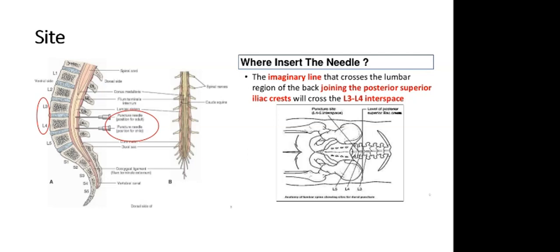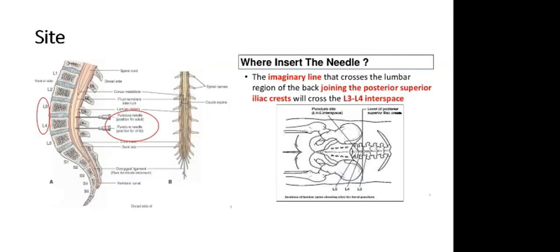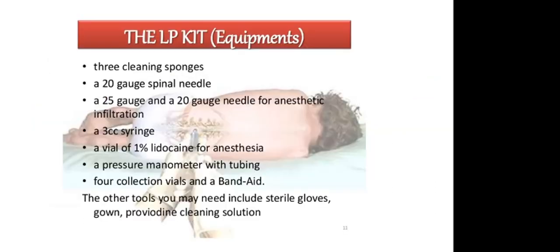So basically, there is marking. We palpate the posterior superior iliac crest, and we draw the line. The line indicates the L4 position. This technique may be helpful. We palpate the posterior iliac crest at the back. So next, that's the site.